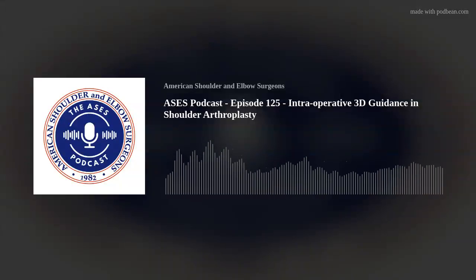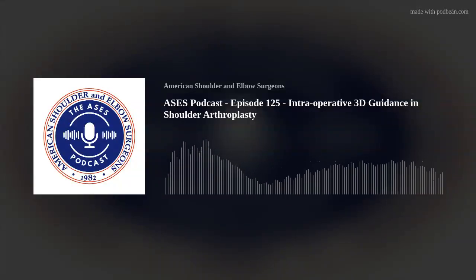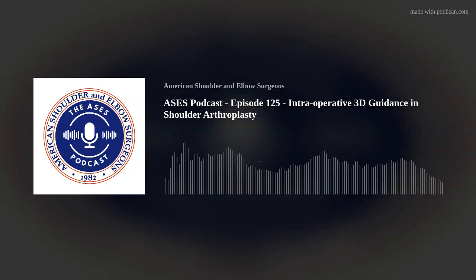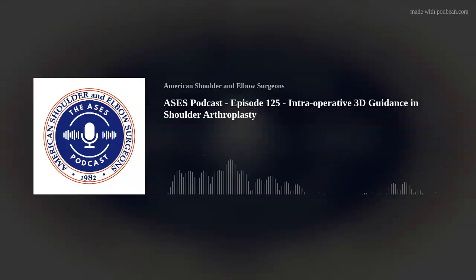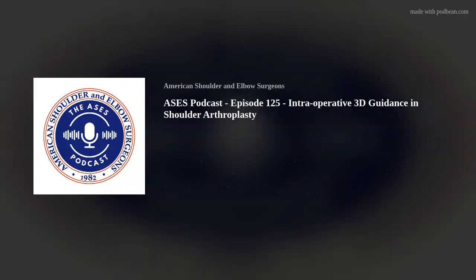And, especially in a reverse, and our studies would show, the ones we did with UF, you put in fewer screws when you navigate as well, because you can put in longer screws. You're in better bone that has better purchase. So you end up spending less time putting in screws. I put 2 into my base plates as long as they're both rocks. Before I had navigation, I would put 3 just for security. So I do think you can make up time on the backside after the registration, which again takes less than 2 minutes once you're up and running past that 5 to 8 case learning curve.